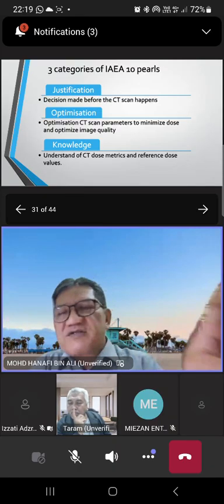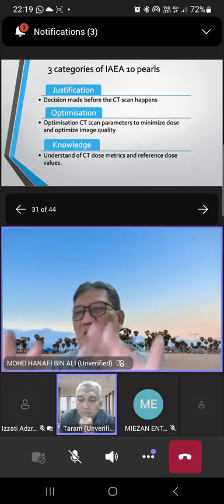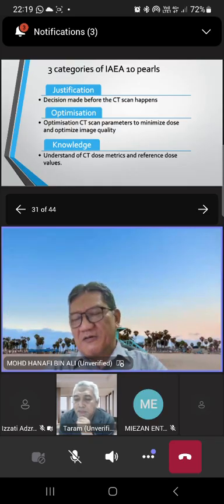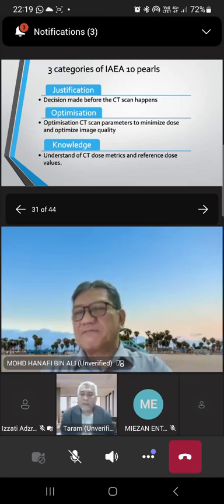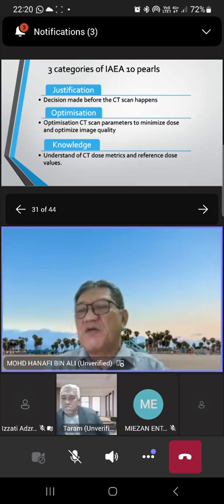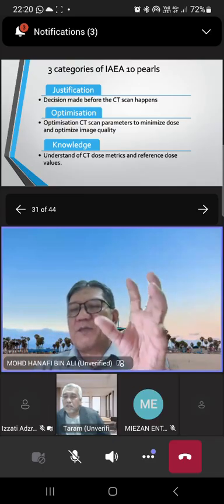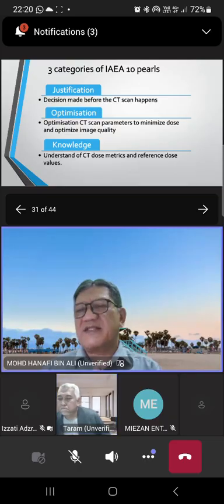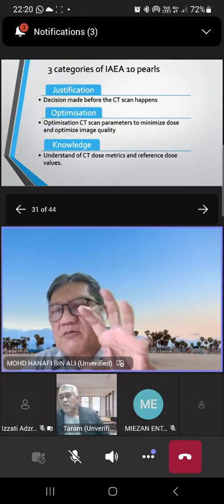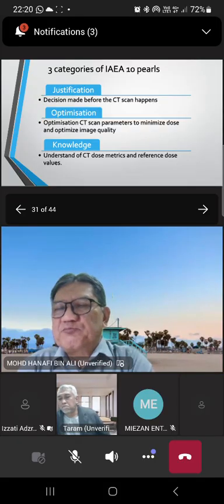Another case is in the old days when they used cathode ray tubes for taking X-rays, and industrial radiation, without protection, and radiologists got skin wounds or something like that because of too much radiation without protection. That is something we cannot compare with normal medical radiation, because the system is quite nice and systematic. We monitor them quite well. Every department has a radiation officer to monitor that.